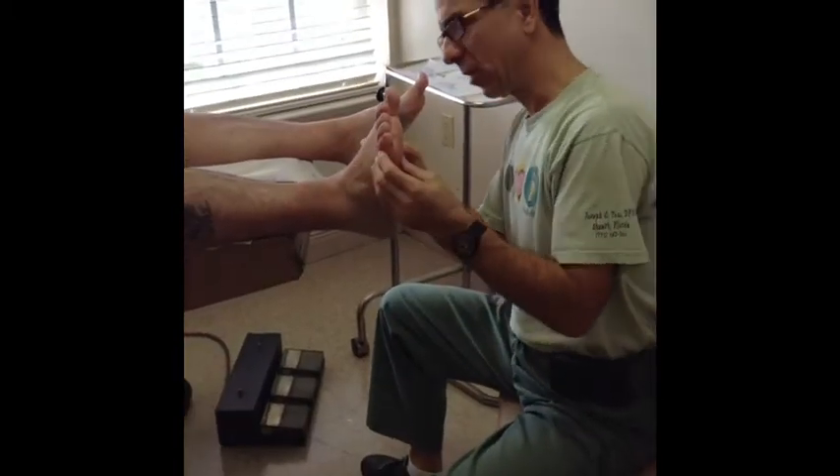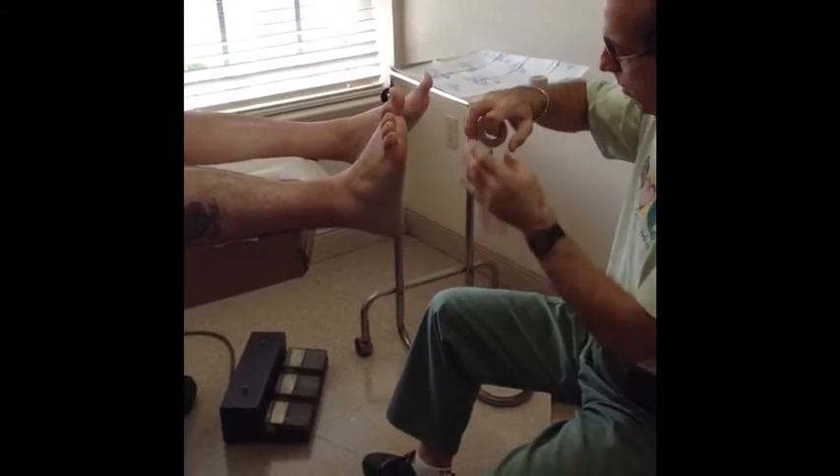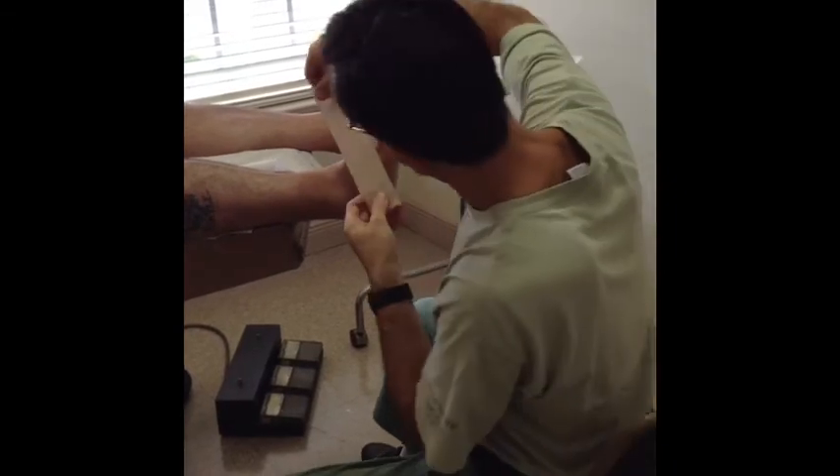The patient just has to pull down the sides when they want to remove it. Prior to doing that, they disconnect this piece from the bottom, which prevents it from rolling down.